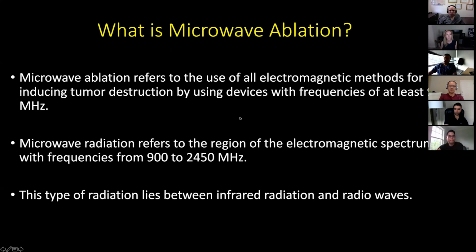As I said, I use microwave ablation. I just wanted to give an idea of what exactly this is. This is actually an electromagnetic way of inducing tumor destruction. There is no electric circuit.